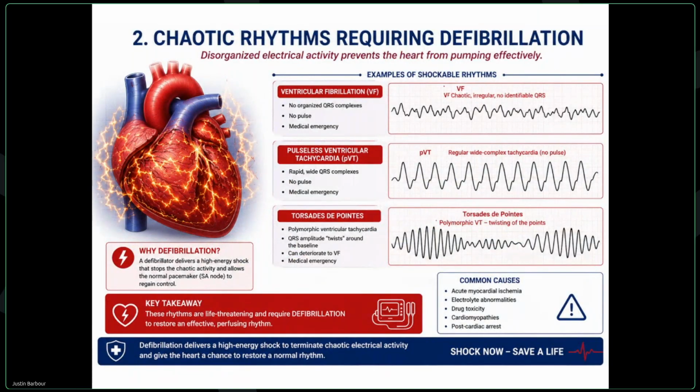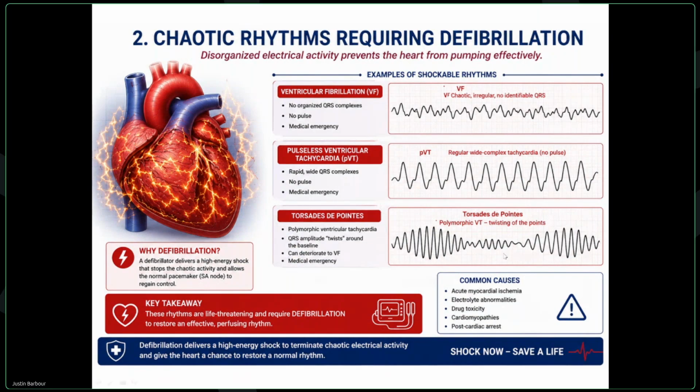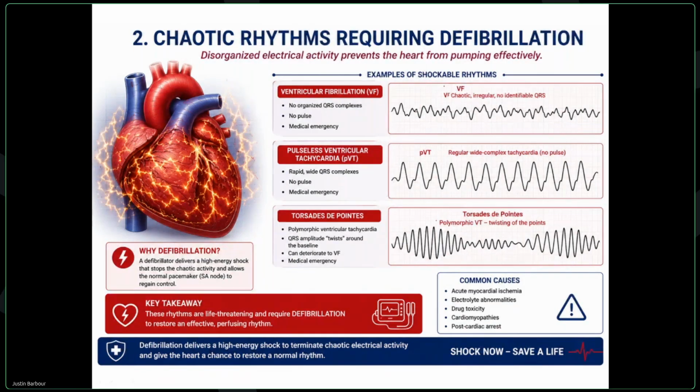So let's talk about defibrillation, because some people have a misunderstanding of pacing versus defibrillation. You can see I've got a couple examples over here on the right-hand side. These are what the heart is trying to do when it's trying to create that normal atrioventricular pulse. And you can see right here, it's just quivering. That's why it looks like random noise. It's not random noise, but the heart is not polarizing and depolarizing completely. It's just sitting there and it's partially squeezing and contracting. And so you are getting little to no blood flow whatsoever with ventricular fibrillation like you see here.